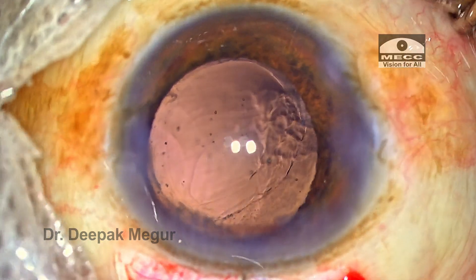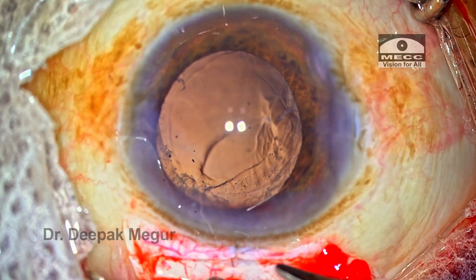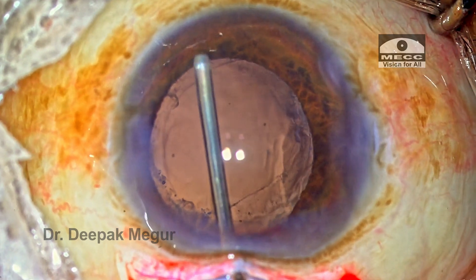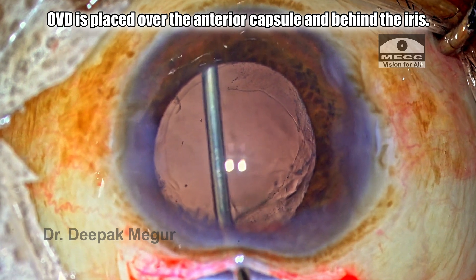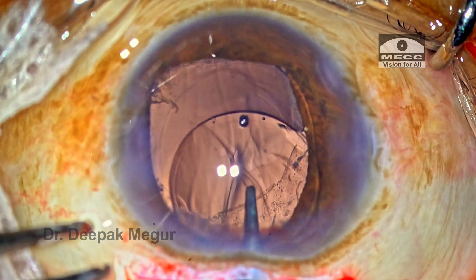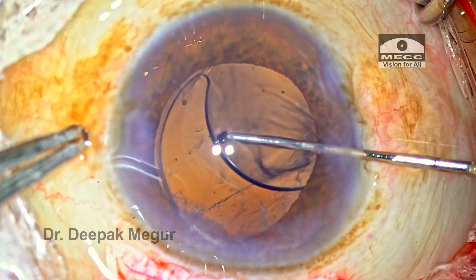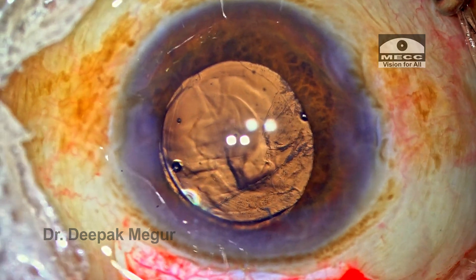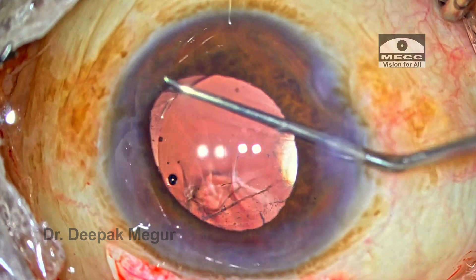Now is the time to put in the lens. She is going to implant a single-piece PMMA lens because we have a large wound. It is acceptable to place the PMMA lens in the sulcus — the haptics are very thin and will not induce irritation to the iris or ciliary body, unlike single-piece hydrophobic lenses. OVD is placed in front of the intracapsular space and behind the iris to create and maintain the ciliary sulcus space. The distal haptic is gently negotiated under it, and then the trailing haptic is carefully dialed in. Both haptics are now in the sulcus. The rhexis is a little large and optic capture may not be possible.